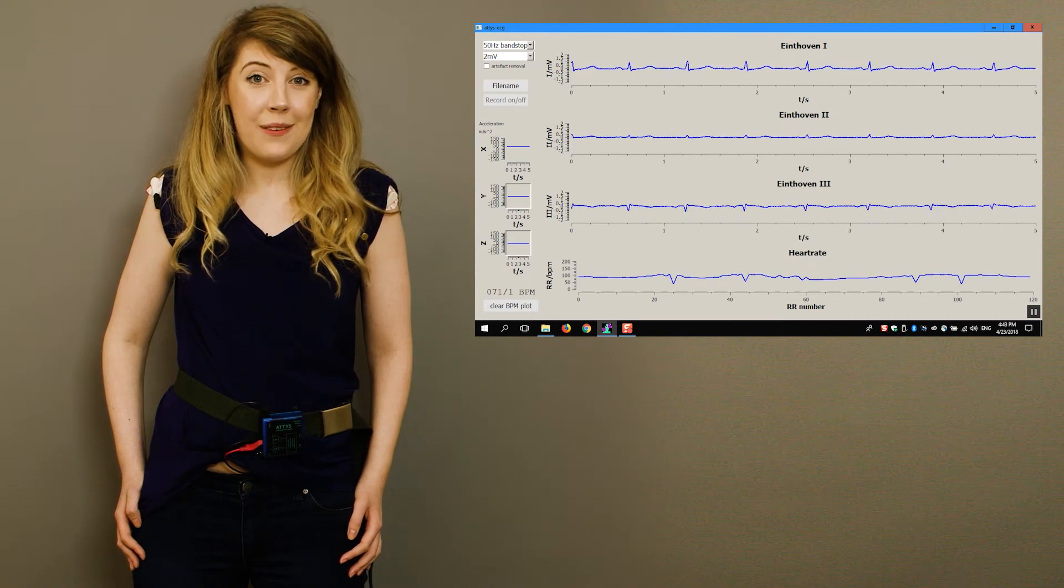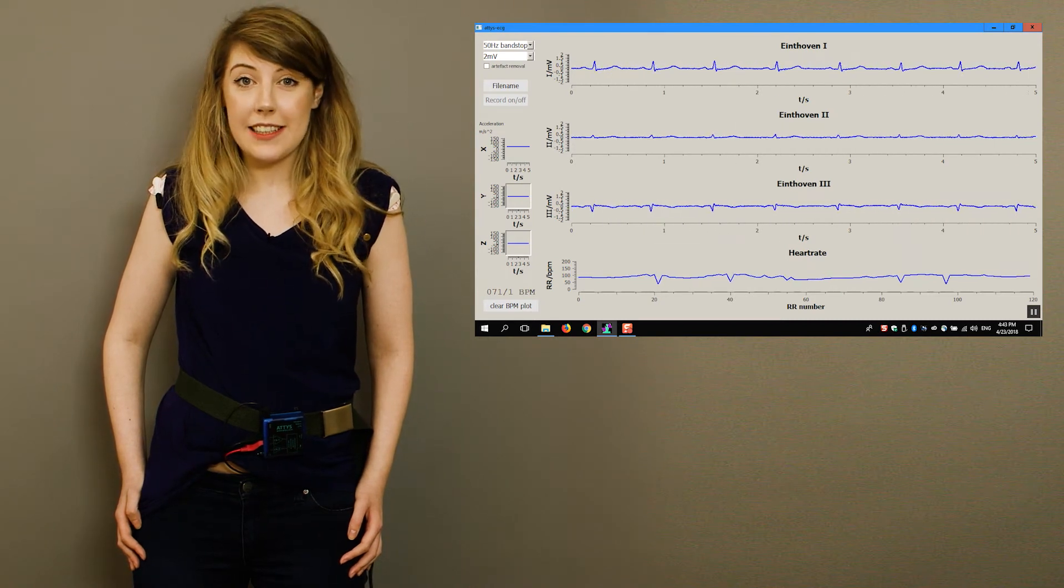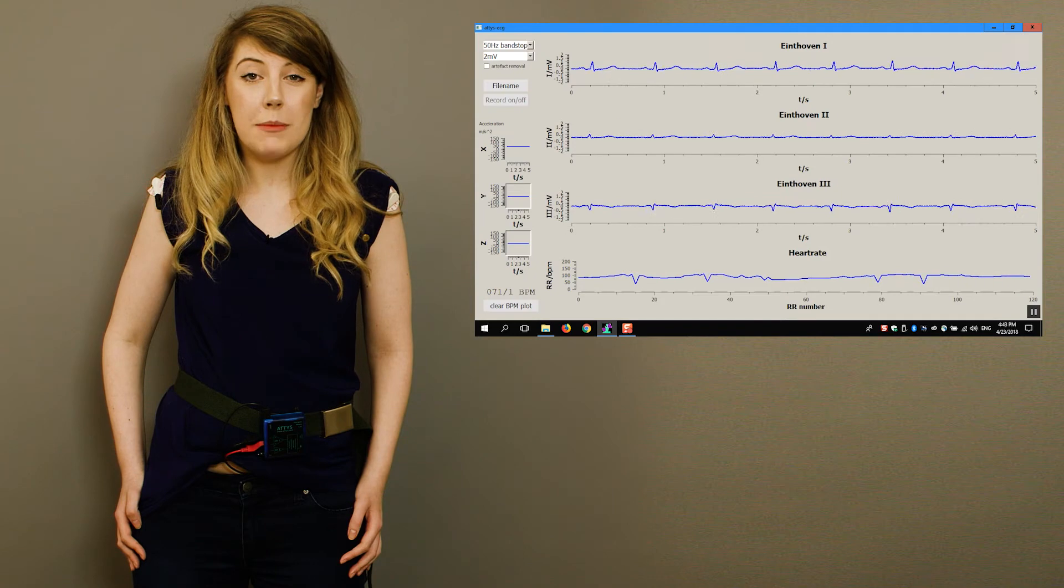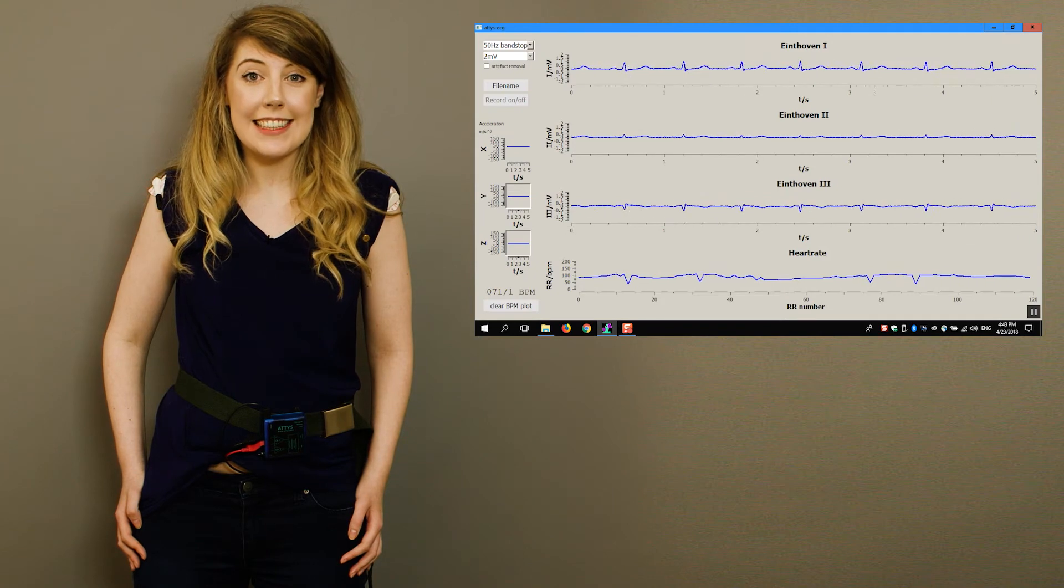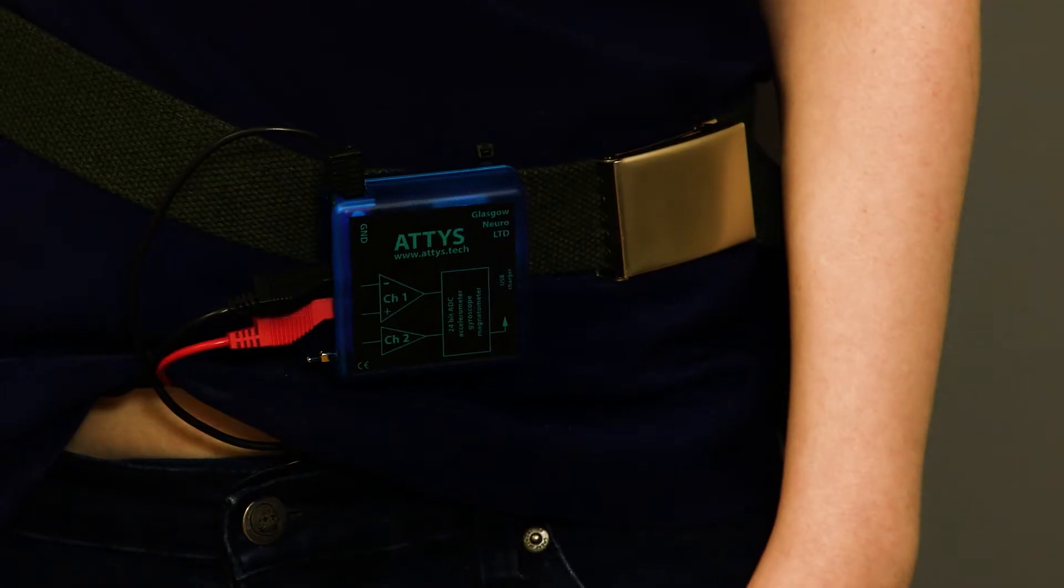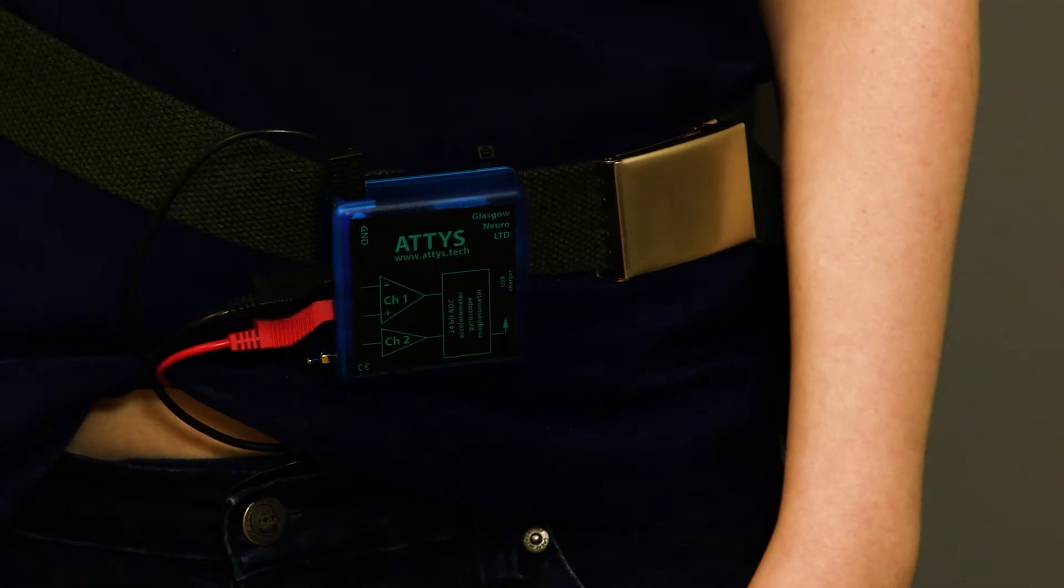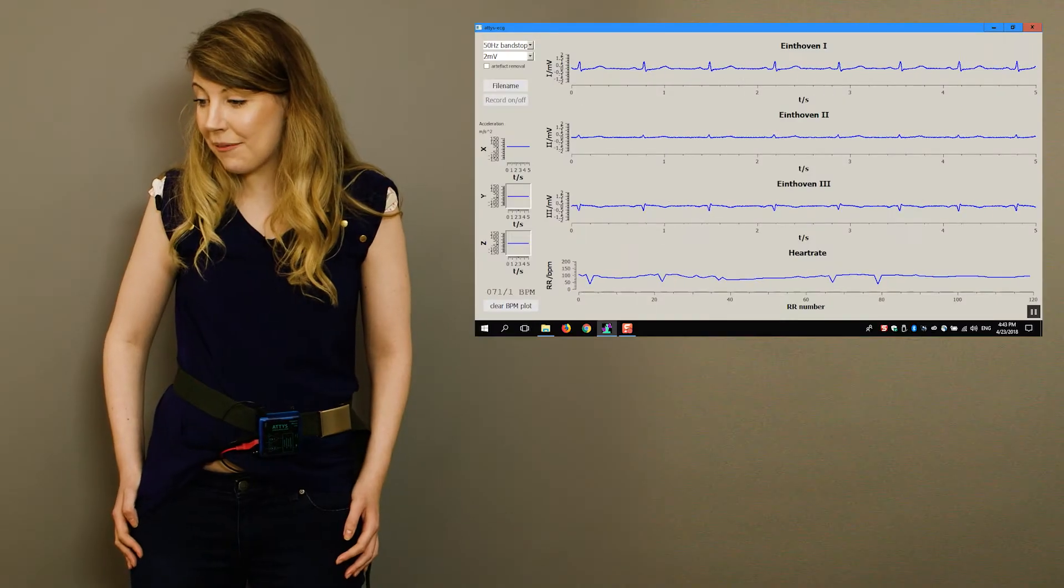Now, as a final step, we can use the accelerometer in the ATIS. You can see the signal on the side here.